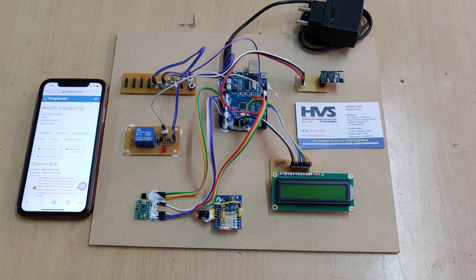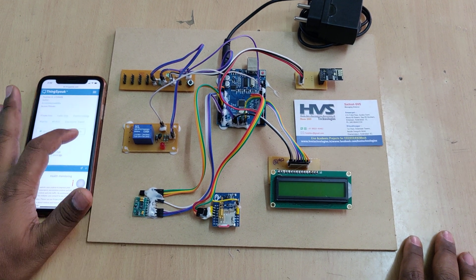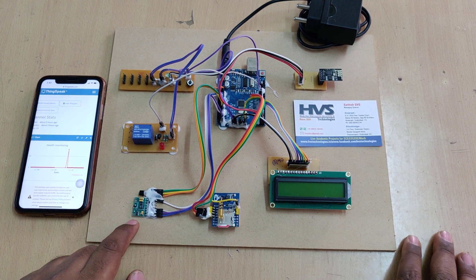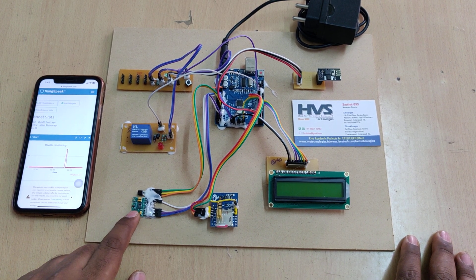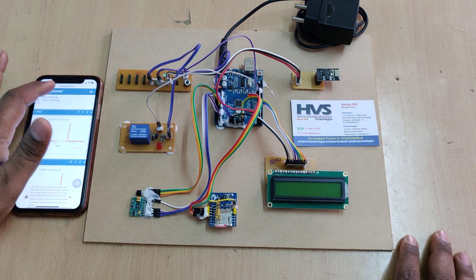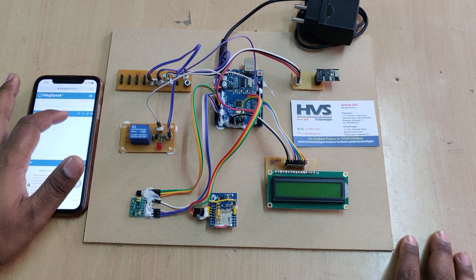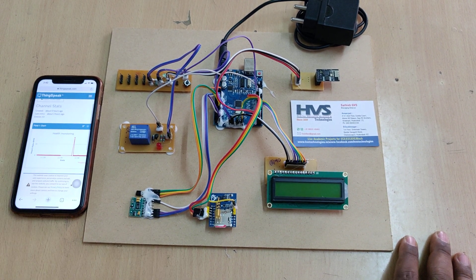Welcome to the project demonstration of a patient health monitoring system with SMS alerts and ThingSpeak cloud storage. In this project we are monitoring three health parameters: heartbeat and pulse oximeter from the MAX30100 sensor, and an LM35 temperature sensor. Based on these three inputs, we upload the data — heartbeat, SpO2, and temperature — to the ThingSpeak cloud platform. If any abnormality is detected, the system will send SMS alerts to a predefined stored number.